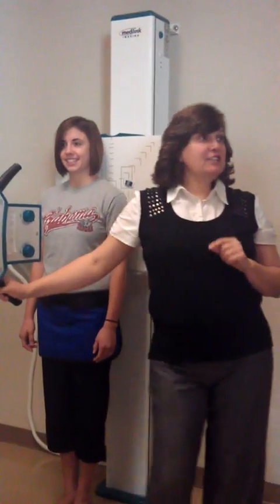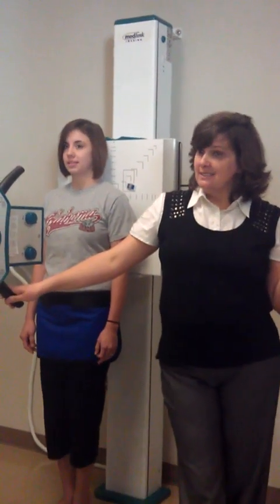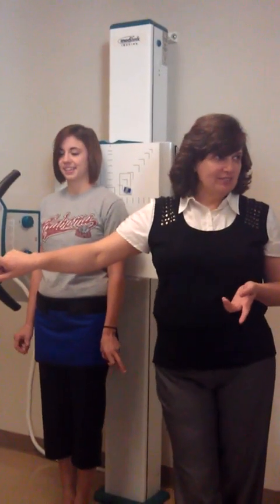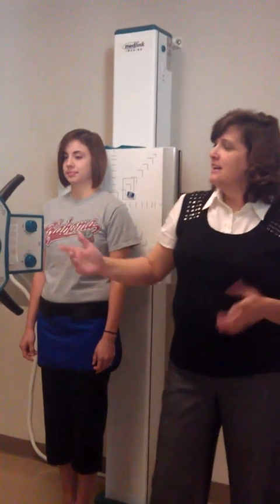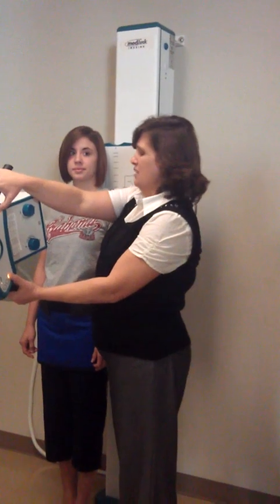We're angling 15 degrees. We're on 90, plus 15 is 105, so this should read 105. The 40 SID — that number's going away. Anytime you throw an angle at the wall bucky, this number disappears, but you're already locked in at 40, so you don't have to worry about finding that 40 again because it ain't coming back. No matter what button you press, you've got to put it back on 90 — it's gone. So when we angle, there's no difference.